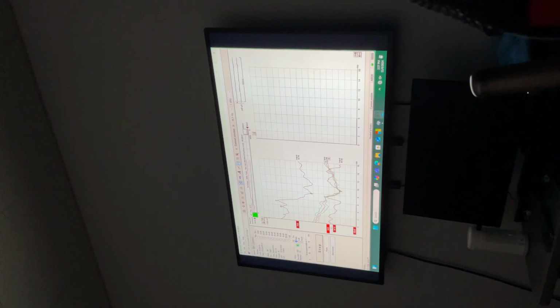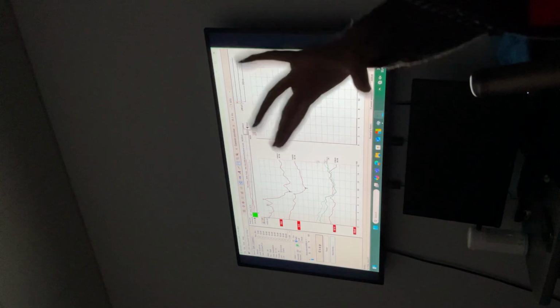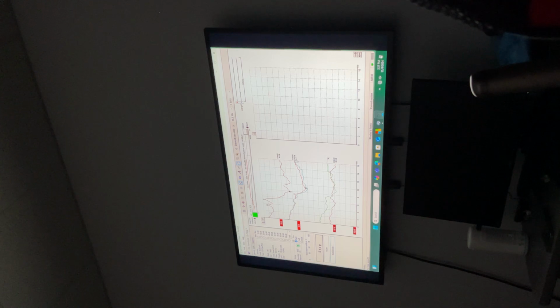But it never showed up when I was marking it for click. Oh, it is there, there's normative data, I'll show you the settings. Okay. Just leave it there. I tried to look at the latency 6,000 sweep too, and the green average normative data wasn't showing up for that either. FYI. Yeah, I'll look at it.